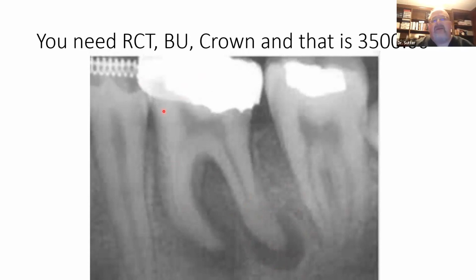So you get the root canal, you get the buildup, you get the crown. It's like $3,500, being very conservative. But the patient can see this, okay? They don't need to be a dentist to know that this is very different than this, okay?